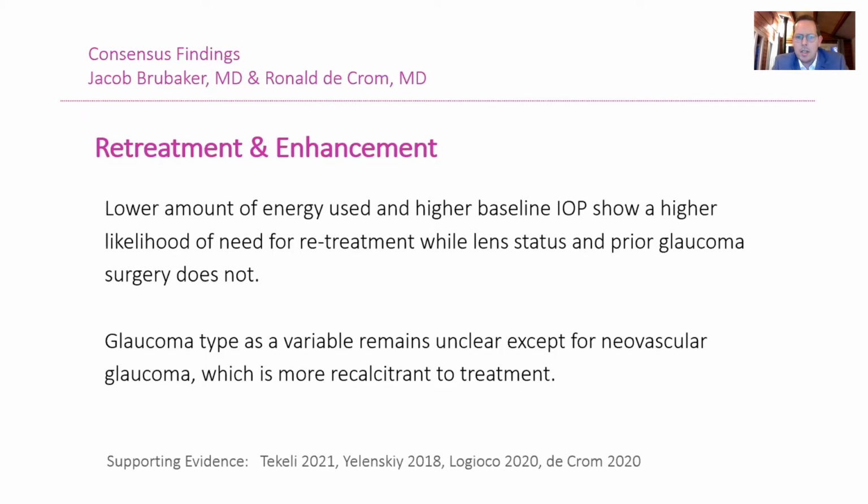Glaucoma type is always a little bit difficult to say. Tom already told us a little bit about it. We know that the glaucoma type as a variable remains unclear, whether it gives a higher retreatment rate or not. But neovascular glaucoma is a little bit more hard to treat.